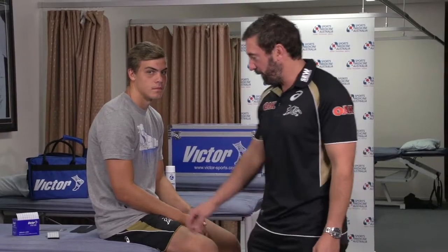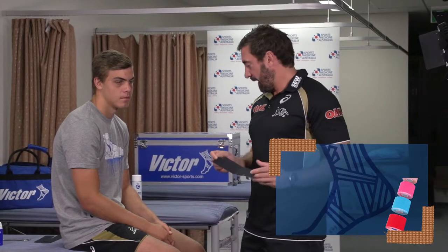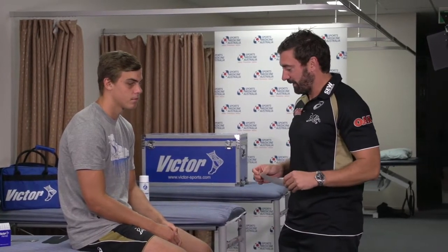So today we're going to go through some basic principles on how to use K-tape. I'm sure we've all seen this stretch tape before. We're just going to go through some basic applications. This is Jack from Penrith Panthers SG ball team. He's going to help us out today.